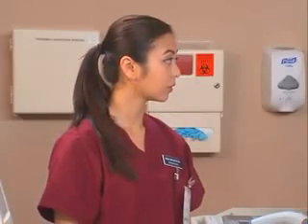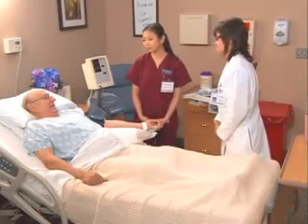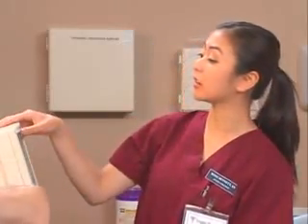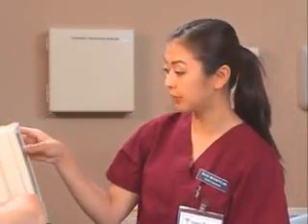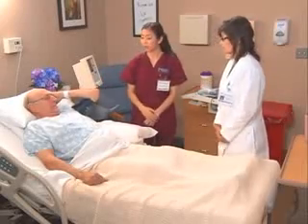Yes, incomplete deflation of the cuff between measurements can lead to inadequate arterial perfusion and venous drainage, compromising circulation into the limb. Well, I hate when that happens. I always double check. And does the machine have different settings for infants, children, and adults? Okay, yep, I've got it on adult settings every 15 minutes. And of course, you'll want to instruct the patient to hold his limb still.